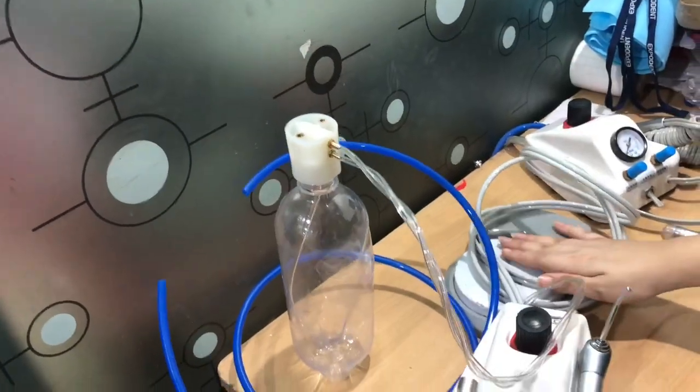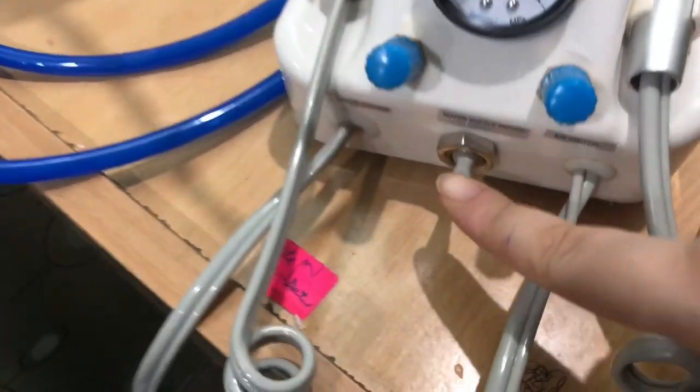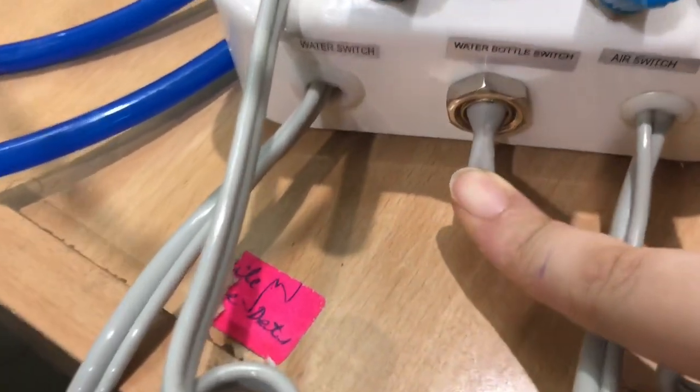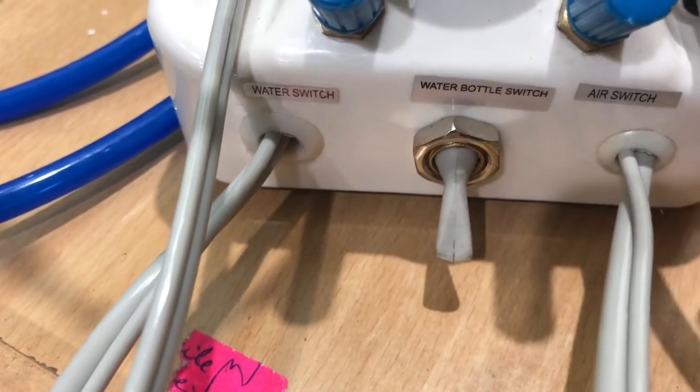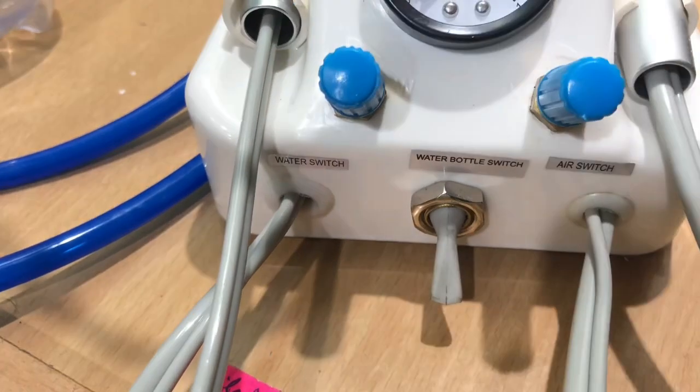This is the tube and this is the foot control. You can see what are the parts here. This is the water bottle switch, this is the air switch to control your air, and this is the water switch to control your water.